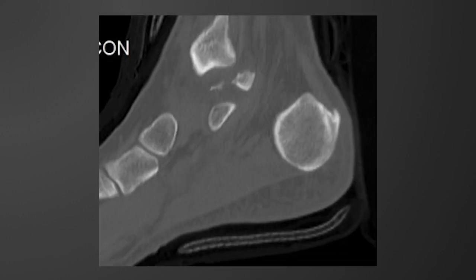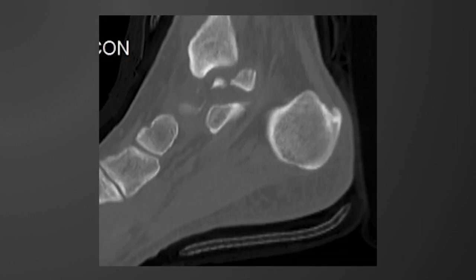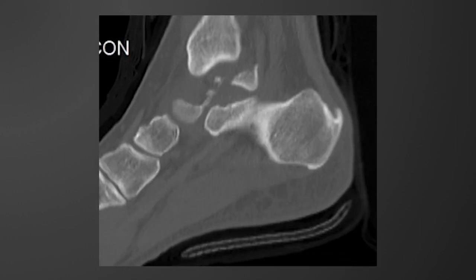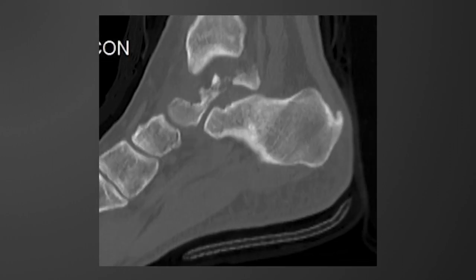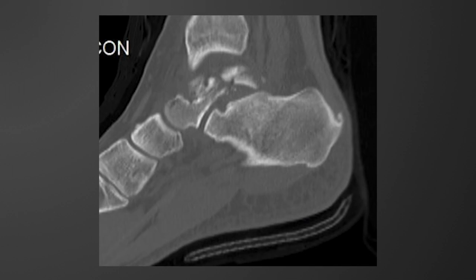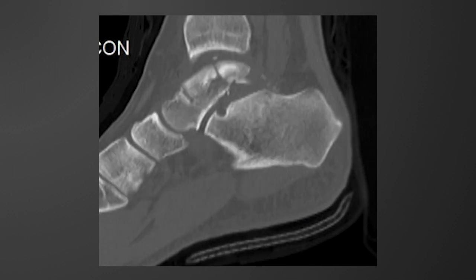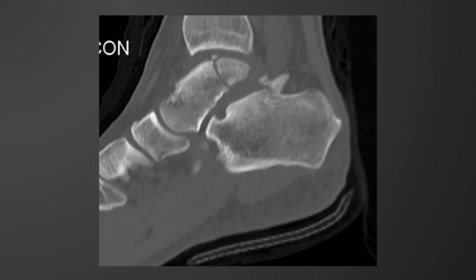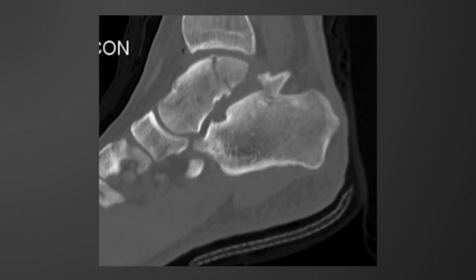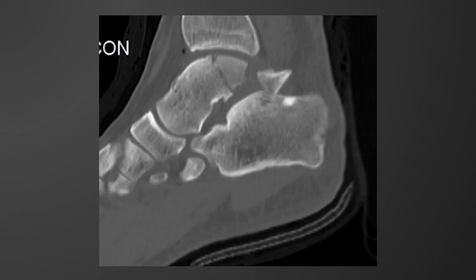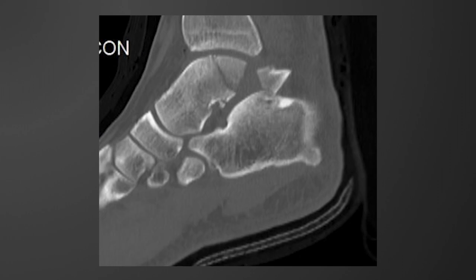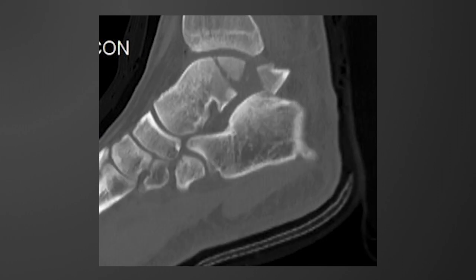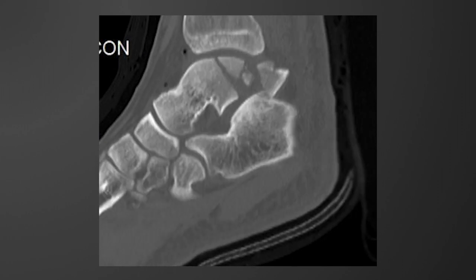The sagittal imaging again demonstrates not only comminution of the talar body but also subluxation of the posterior facet of the talocalcaneal articulation.